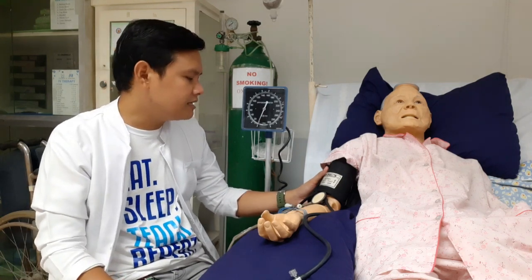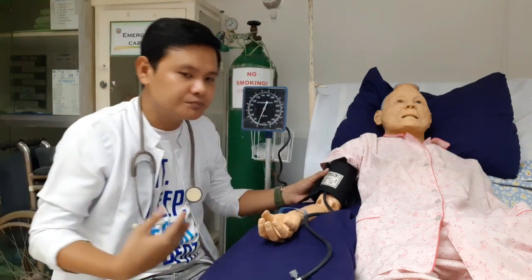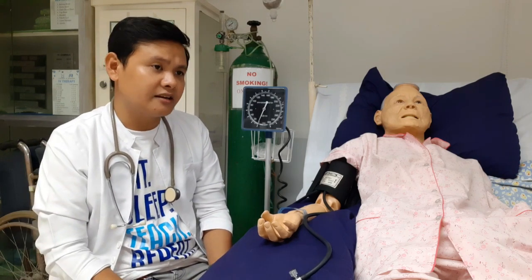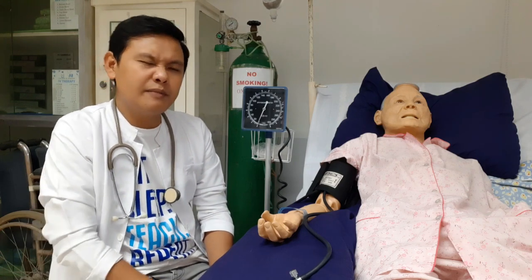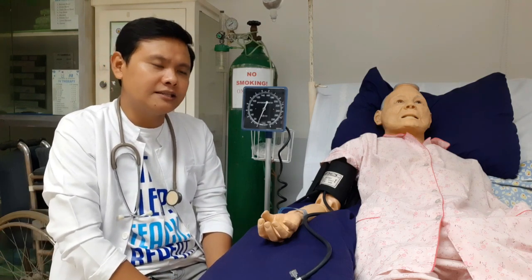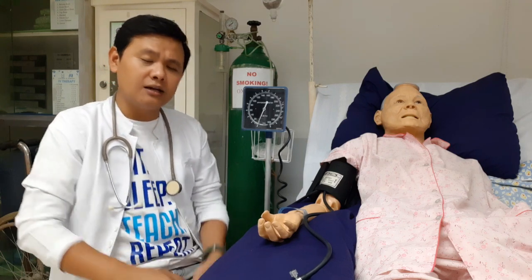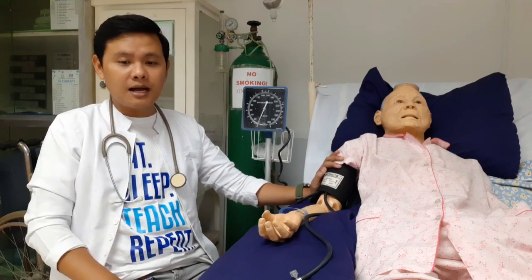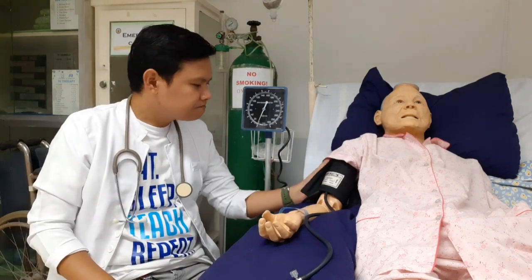Okay? So after reading it, after getting the results, okay, remove na natin yung BP cuff natin, and then evaluate na natin and document na natin yung nangyari. Okay, of course, you have to document the blood pressure in the vital signs record sheet. The vital signs record sheet is something that I'm going to teach you guys maybe by next week. Okay, what else? Report natin dun sa may nurse or sa may clinical instructor natin if there are any abnormalities na nakita natin sa pag-check ng BP ng pasyente natin. Ano pa? Document din natin the procedure in the client's record. Okay, chart natin dun.